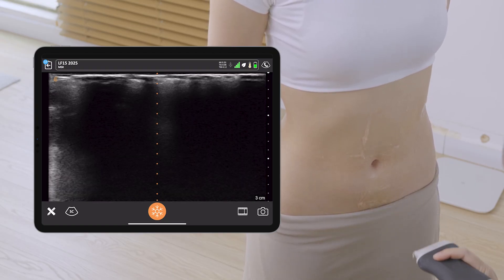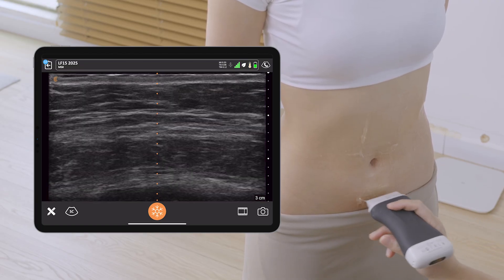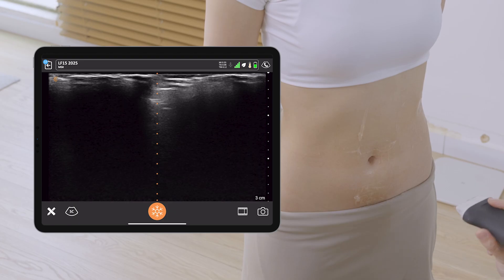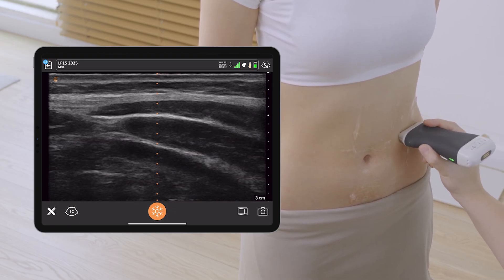The patient doesn't have any diastasis recti. She has very good muscle tone and very little fat. Now, another part to assess is her linea semilunaris, and I start on the left side.